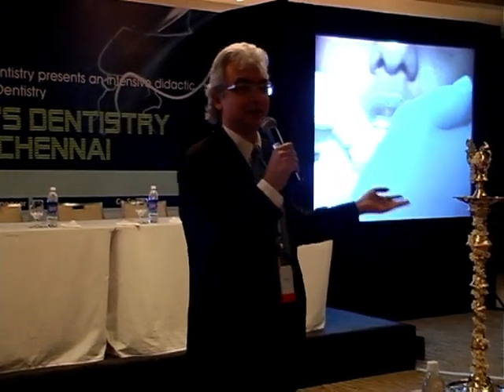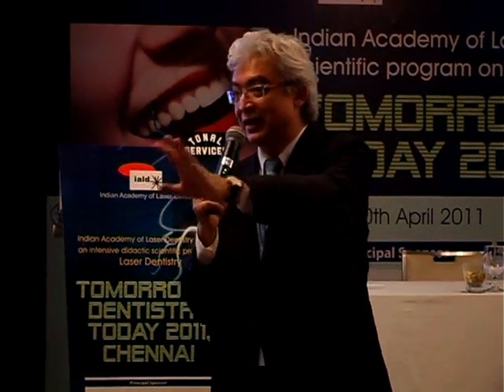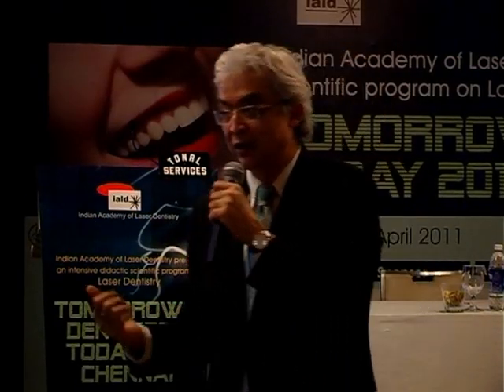Very interesting questions are coming up. So if there are more questions, please. Is it effective in removing subgingival calculus? Again, it's a very good question. There is one erbium laser which actually has a feedback mechanism, and they market it like that. It's the key laser, and it has a diagnostic laser attached to it as well. And it is reasonably effective, again, from all the studies we've seen. It's very effective in removing subgingival calculus.